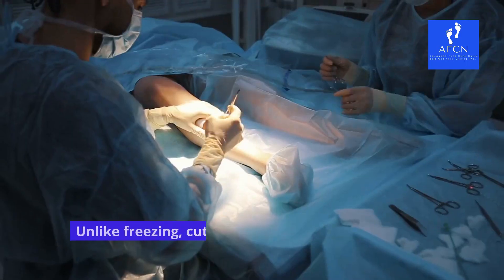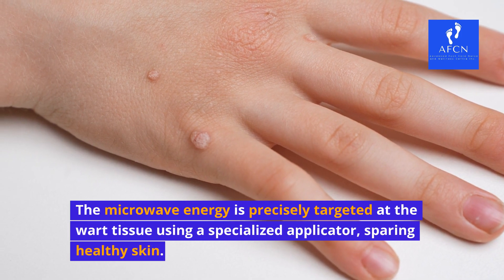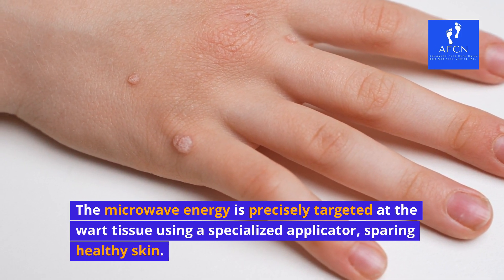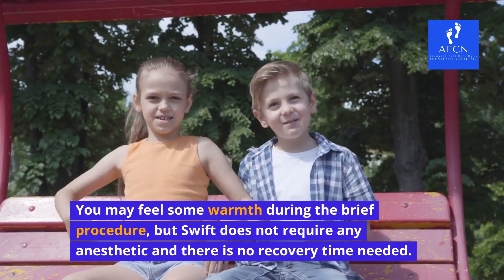A painless procedure. Unlike freezing, cutting, or burning, Swift is non-invasive and painless. The microwave energy is precisely targeted at the wart tissue using a specialized applicator, sparing healthy skin. You may feel some warmth during the brief procedure, but Swift does not require any anesthetic and there is no recovery time needed.